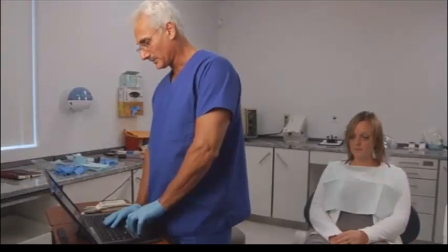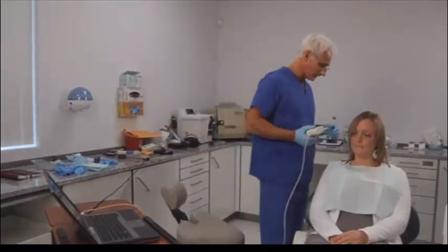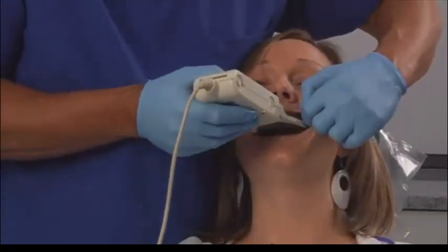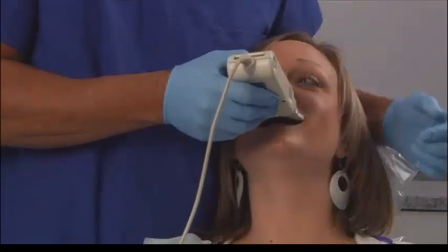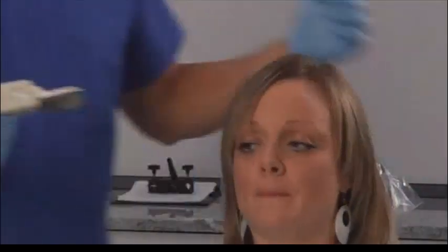To choose a proper sensitivity, Caroline, I'm going to have you bite into the sensor, and I'm going to have you keep your teeth together when you do that. So I want you to bite down for me. Bring all your back teeth together. Try to squeeze your back teeth together. Much better. Do that again for me. Bite down again. Good, like that. And open. Bite down again. Good, and open. Raise the level a little. So we like to see 3 pink cells total to indicate the proper sensitivity.